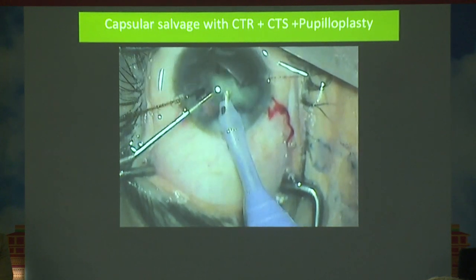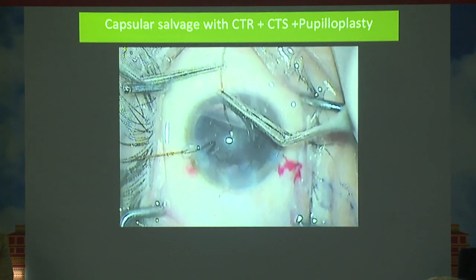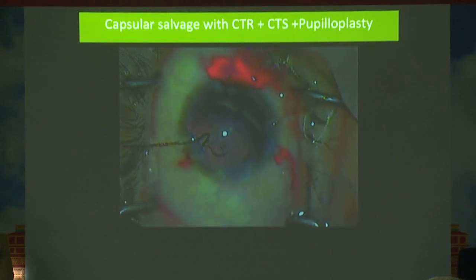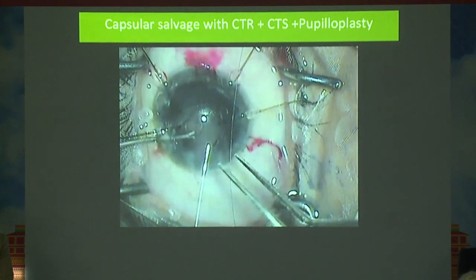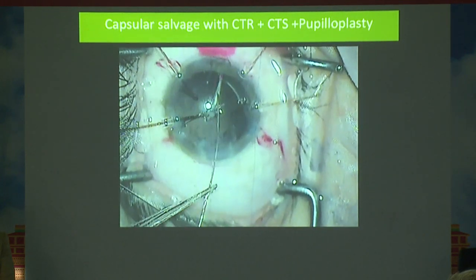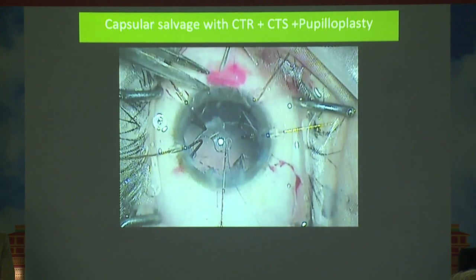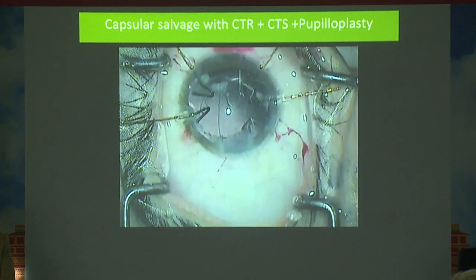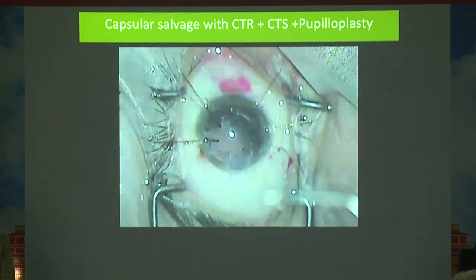of the nucleus. And once we have done that, we proceed with fixing the CTS using 10-0 prolene sutures and making a Hoffman pocket. What we use is the new device Hoffman pockets, in which you enter through the limbal incision and make a pocket, and then once you have dissected 2 mm in the scleral plane, you pass it by using the railroad technique. Once you have passed the prolene through the railroad technique, you retrieve the prolene from the groove. And since it's from the limbus towards the sclera, you have virtually not dissected the conjunctiva, and it's a complete integrity of the conjunctiva.